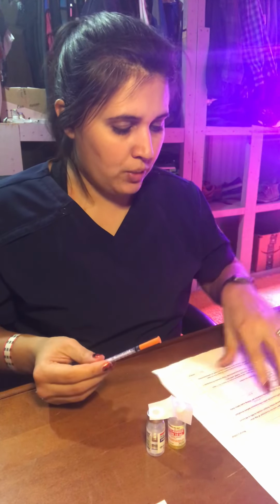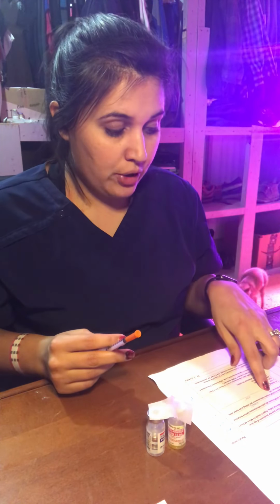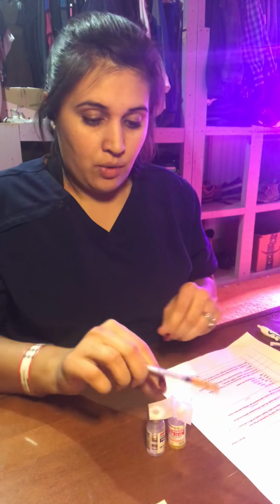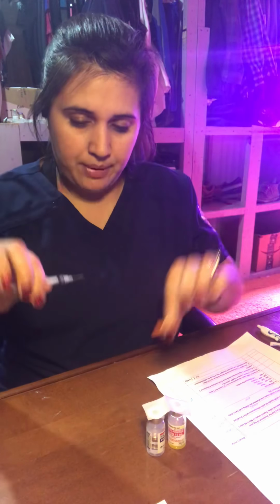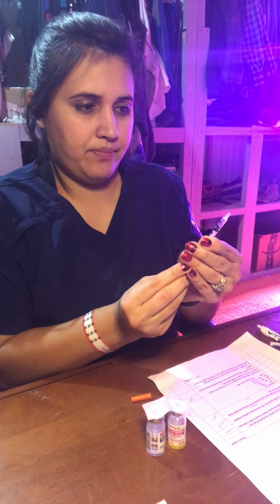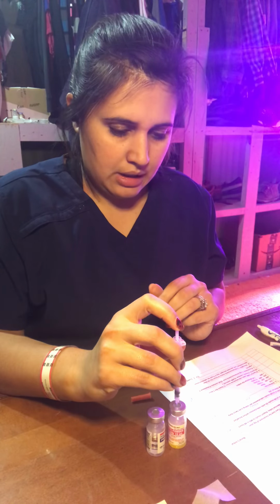Now it is asking for 20 units subcutaneous before breakfast of the NPH, which is the cloudy, and his blood glucose level is 245, which on the sliding scale gives him 10 units of the clear regular insulin. So what I will do is pull off the cap, grab 20 units of air, and insert that into the NPH insulin.